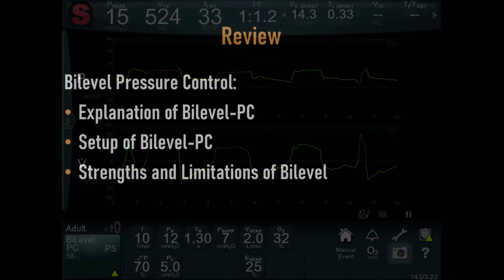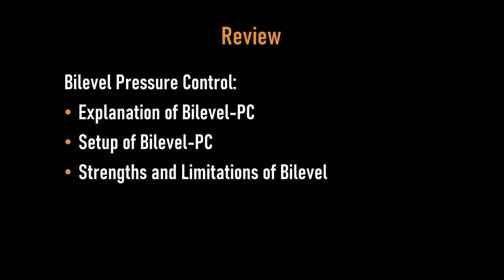So let's review the tutorial. In this tutorial, I talked about bi-level pressure control and why it's a relatively novel mode of ventilation that's built on top of an active exhalation valve. It's very similar to pressure control ventilation, except for how the spontaneous breath is handled. I discussed how you set up bi-level pressure control, and I discussed the strengths and limitations of this mode.